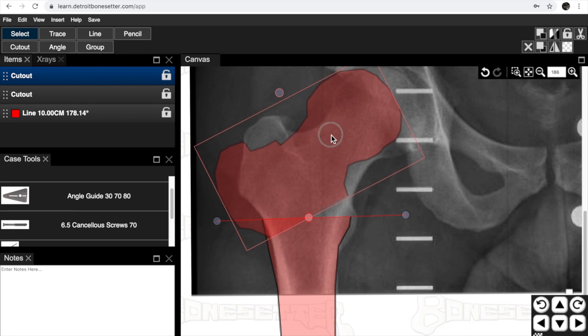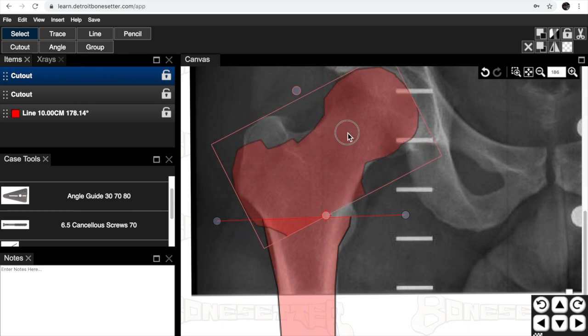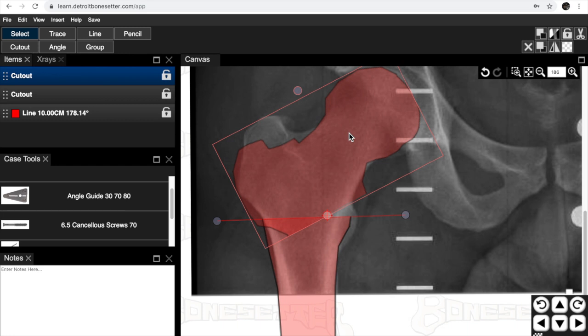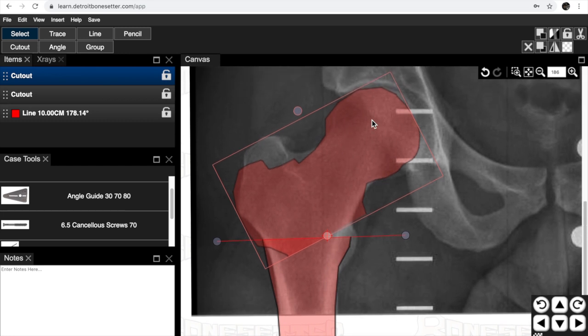We're just going to slide it along a little bit so that we get the two heads to match up. And we know this is about where we're going to make our osteotomy.